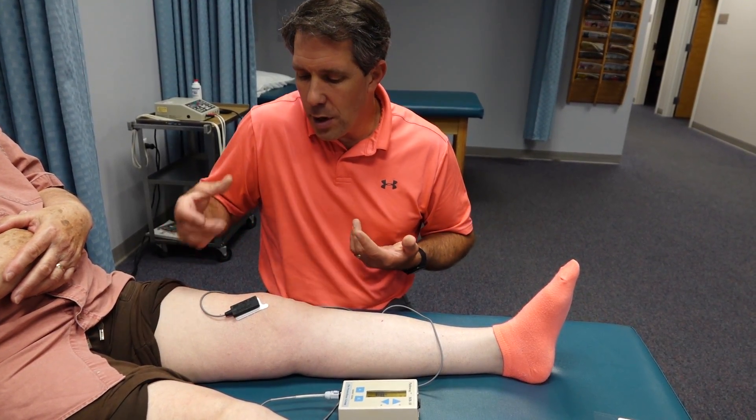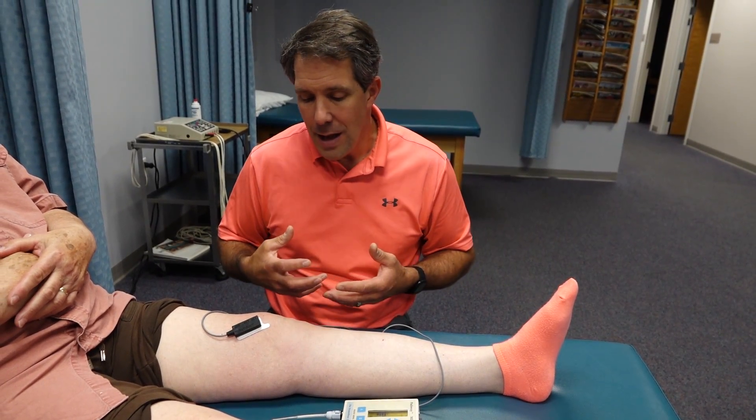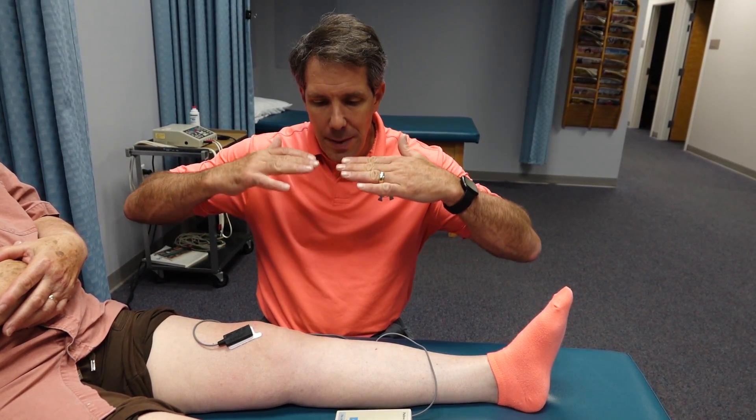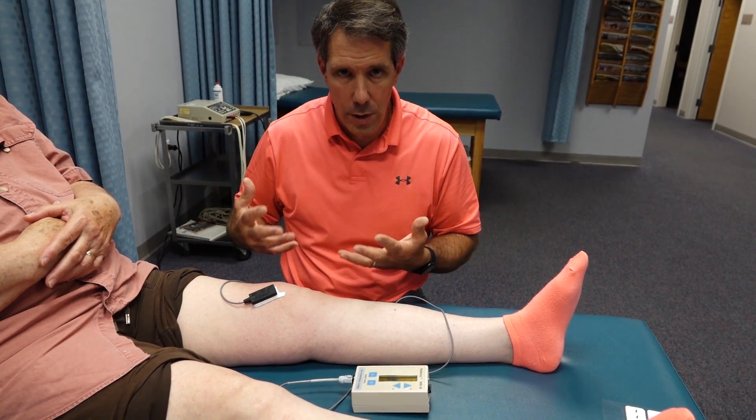So we started to work on some quad sets, but we felt like she could contract her quad a little bit better. And by getting a good quad set, it will optimize the extension and maintain that extension better, which is so important for function.